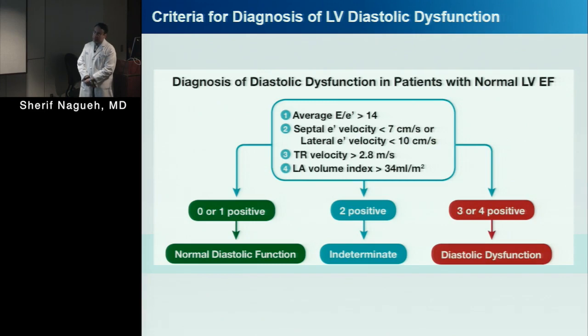Yes. But as individuals put on weight and their body surface area goes up from 1.6 to say 2.4, and the left atrial volume goes from 35 or 36 up to 55, when you correct it, it comes down under 34. Yet they're describing dyspnea, shortness of breath with exertion, climbing stairs. Is that accurate when you correct it? I mean, how do you know that?